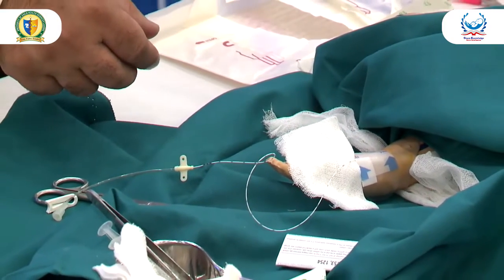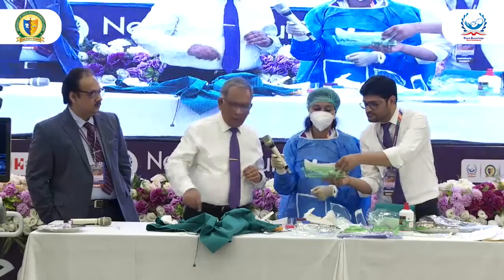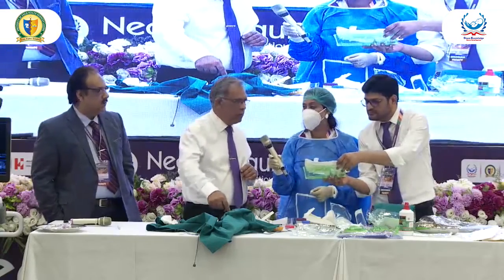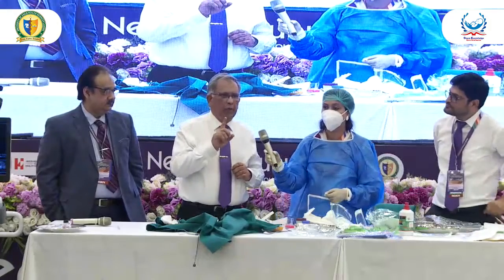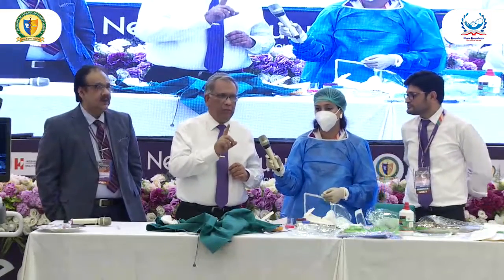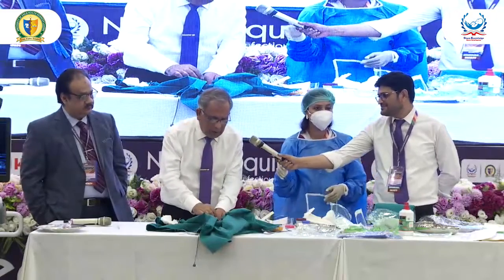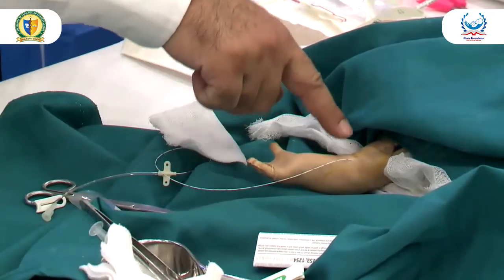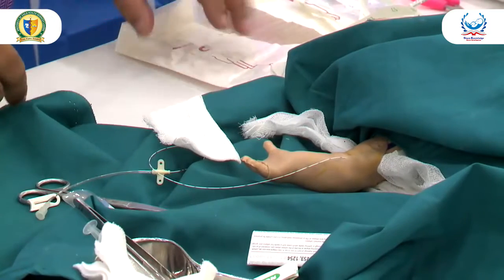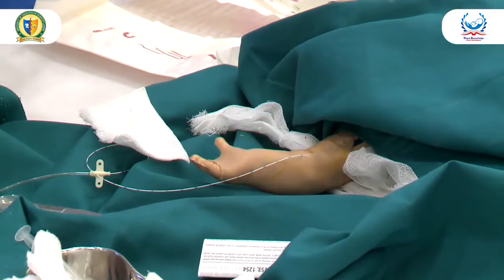Sonia, how long was that? So 20 centimeter. And what was the length from site of insertion to the 12? So if it is a 12 centimeter that you have to put in, try putting in 14. Yeah, exactly. Because then you can withdraw. But once you have achieved this position and you see that it is in subclavian, like Dr. Junaid said, you cannot then push.